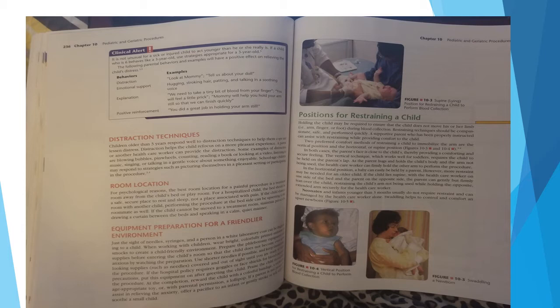Two preferred comfort methods of restraining a child to immobilize the arm are the vertical position and the horizontal or supine position. In both cases, the parent's face is close to the child's, thereby providing a comforting and secure feeling. The vertical technique, which works well for toddlers, requires the child to be held on the parent's lap as the parent hugs and holds the child's body and the arm not being used. The healthcare worker can firmly hold the other arm to perform the procedure.